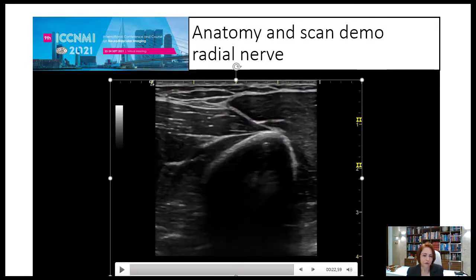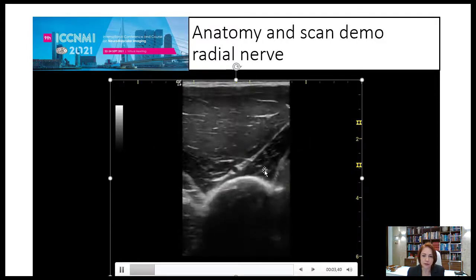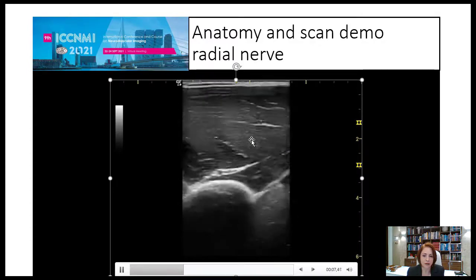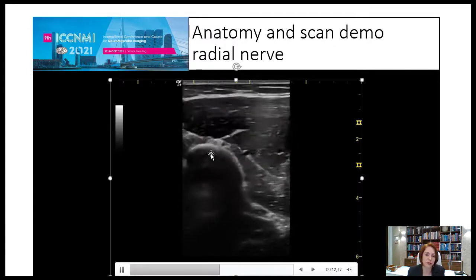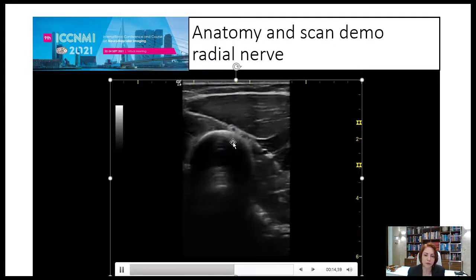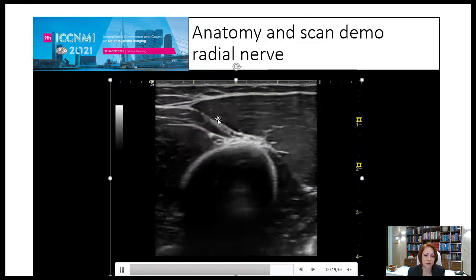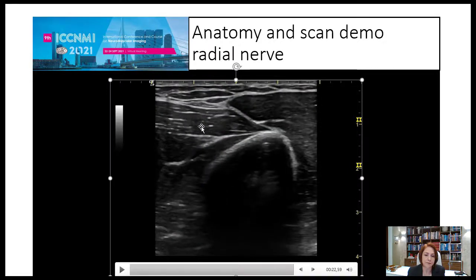Here is a movie showing the proximal trajectory of the radial nerve. You can see the nerve descending from the armpit, passing the medial head and long head of the triceps, winding around the humerus from medial to lateral side along with the deep brachial artery. It then reaches the lateral head of the triceps, pierces the lateral intermuscular septum, and goes beneath the brachioradialis muscle, between it and the brachialis muscle.